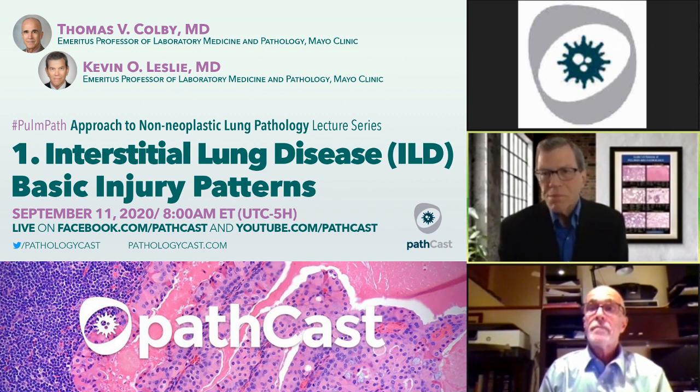Not very helpful because it shows, in that case, an organizing diffuse alveolar damage. In my experience, there are no particularly classical features to tell you it's COVID infection. There are no viropathic cytopathic changes. The patients will often have microvascular thrombosis, but this will occur in nearly all cases of severe acute injury from any cause. Tom, any comments?